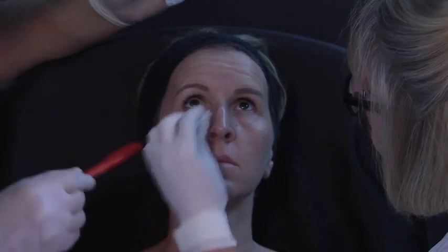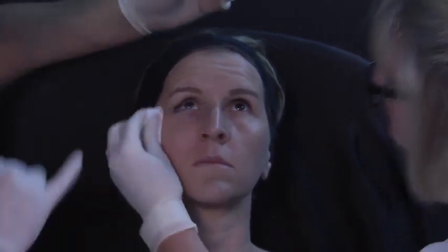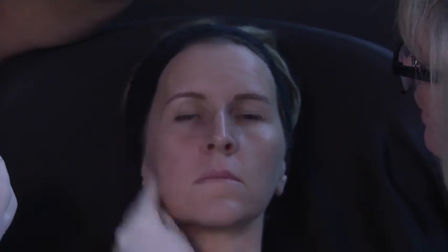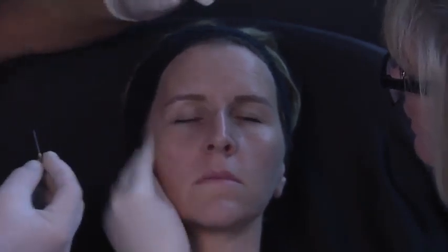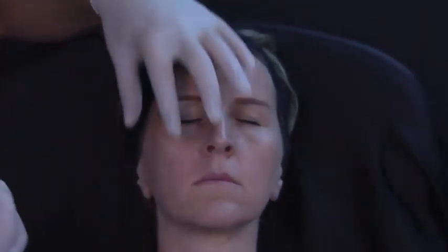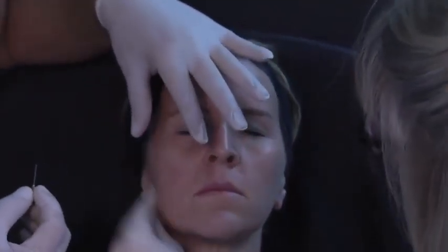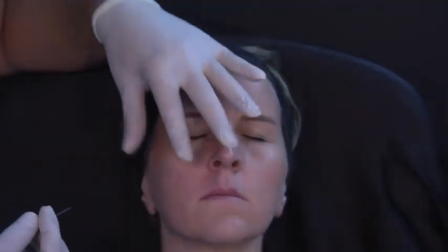So what I'm going to do is go from the lower part of the malar zone, which is a safe area for the entry point. Okay, so I'm going to start. Sure, go with the holotome while I inject. I want to tell you that this is a pioneering technology. This is a surprise that we have for you.